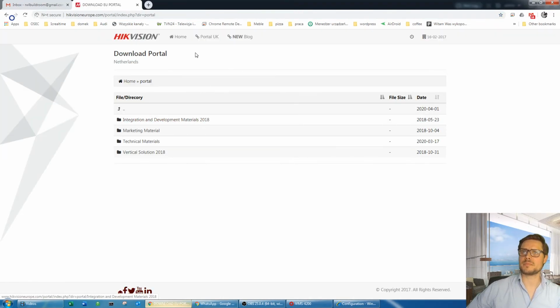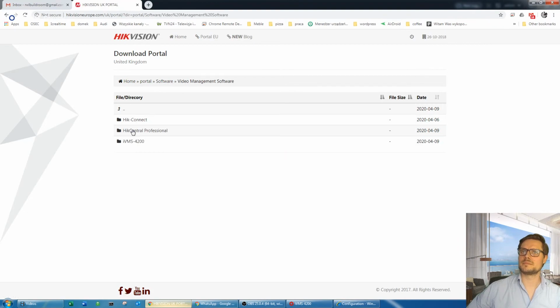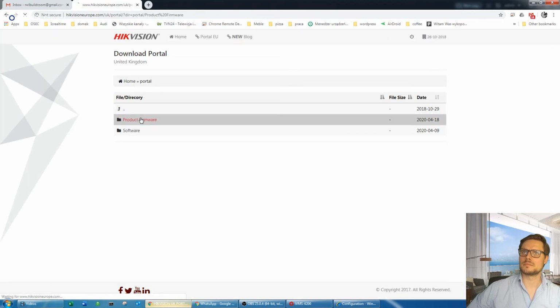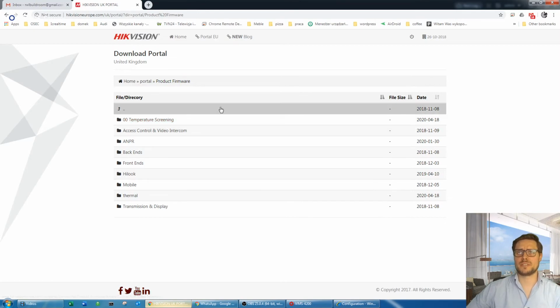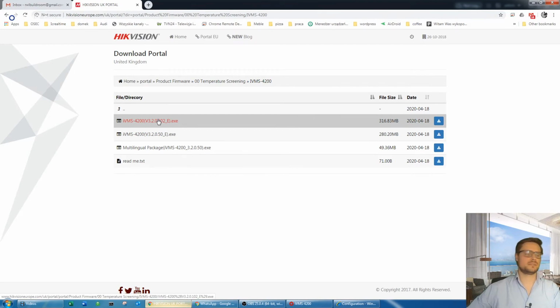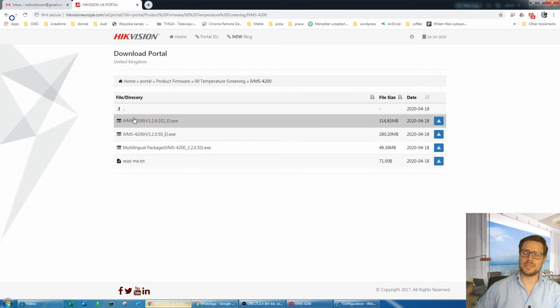So if you go to the Hikvision portal, just make sure you're on the UK one, I'd say. There's the temperature screening in the portal and the product firmware. It's a bit confusing on the portal sometimes, but yes, that's what it is. And there's IVMS 4200, and that's the latest version for that sort of camera. Of course, it's compatible with any other camera as well, so you can use it not just for temperature screening cameras, but also for ordinary cameras.